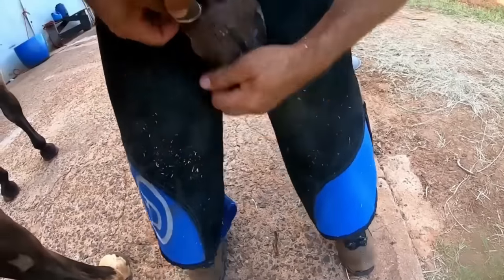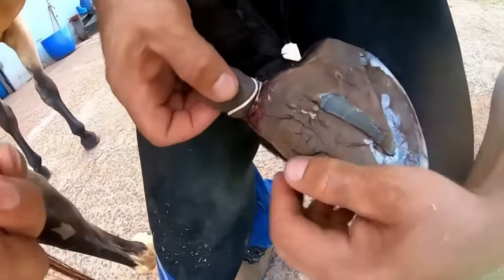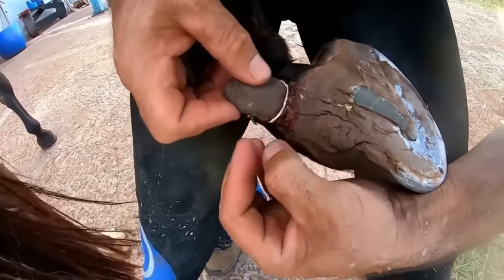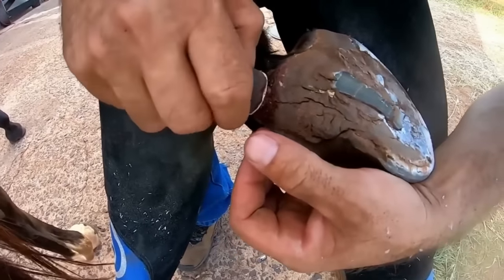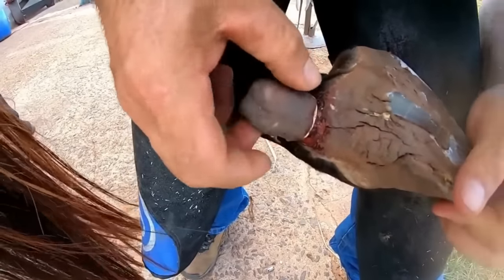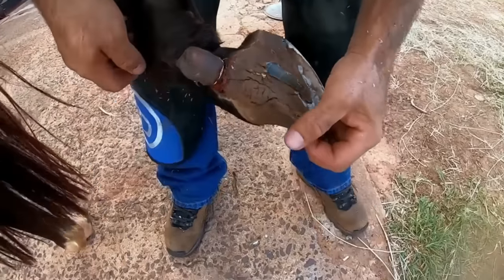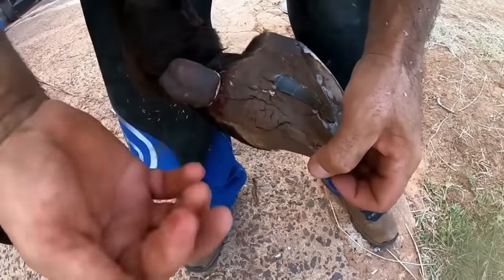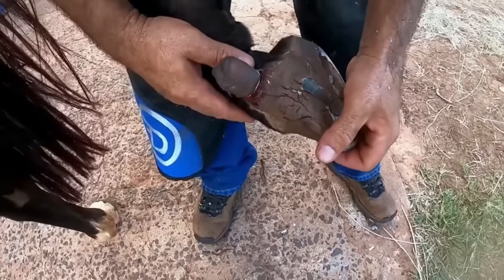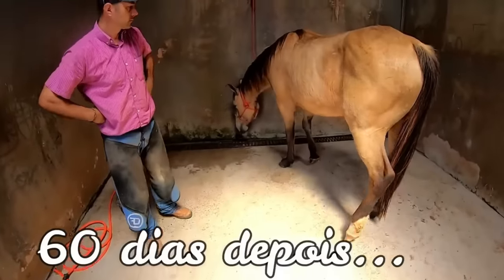I'll hold it here for Renato so it doesn't move too much. What will happen is that the circulation will be held here. When the rubber closes, we will be applying rubbers with more turns later until it falls off in one piece.